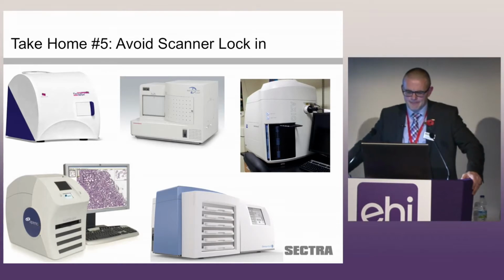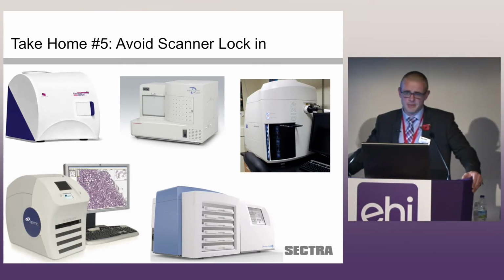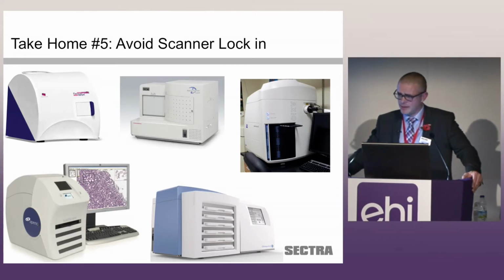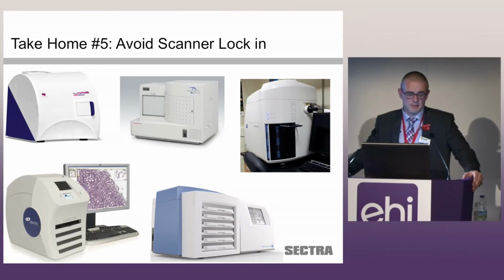Avoid scanner lock-in. As I've already said, the scanner manufacturers have done a great job of bringing digital pathology to the masses. They've quite rightly produced their own viewers to accompany the scanners. Problem is, of course, that they all leverage their own proprietary formats. I would suggest that when looking at pathology solutions, you consider a vendor that can accommodate these proprietary formats, but is already well equipped to handle a DICOM standard when it becomes widely adopted. There are vendors out there that can do both of these scenarios today.